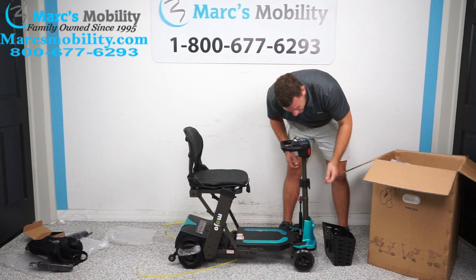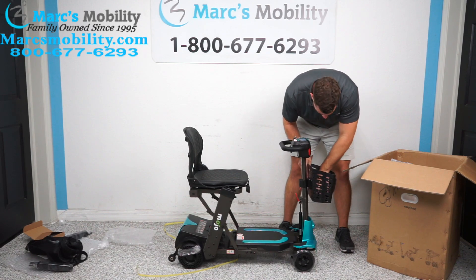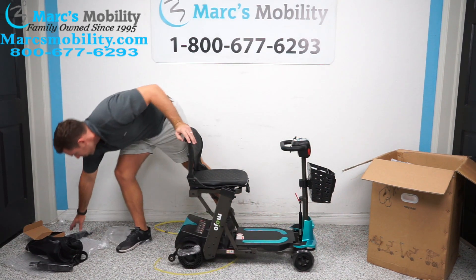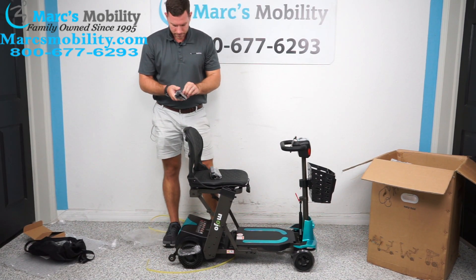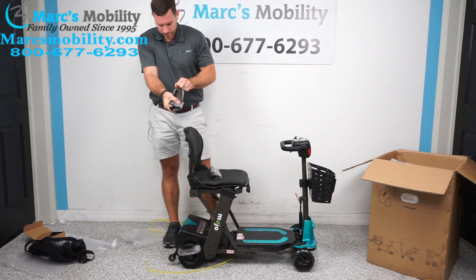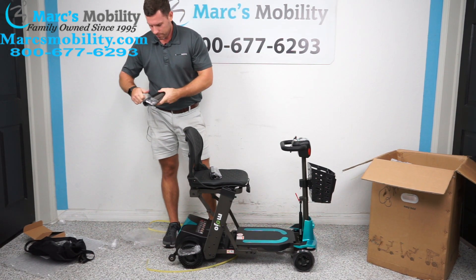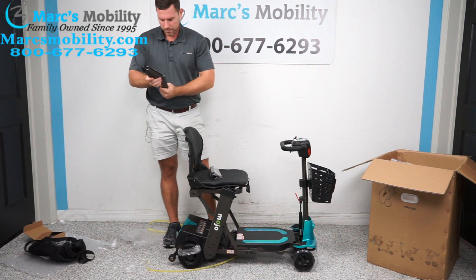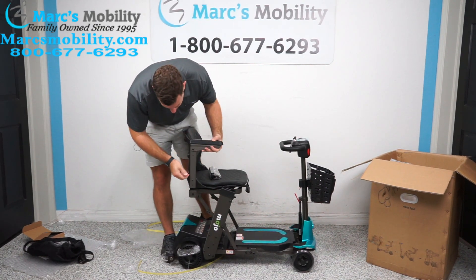There's a red tab right here — raise the tiller up and your front basket will slide on. From here, you also have your armrests. We'll take off the shrink wrap and they will drop in.